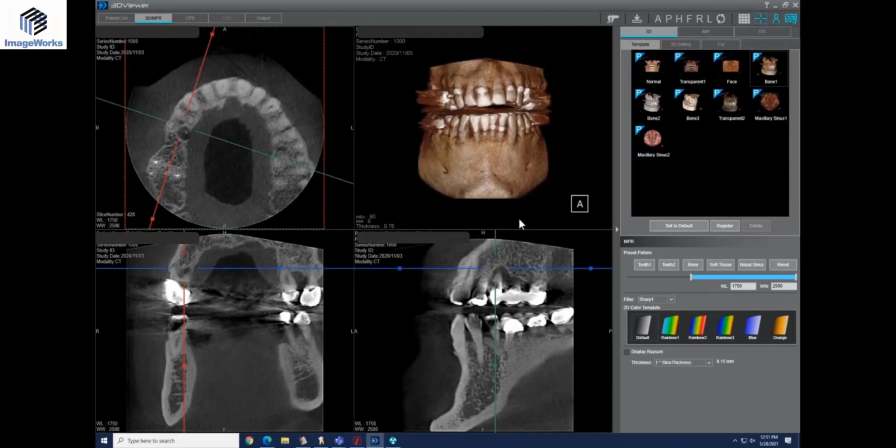But every time, even my staff now, every time I run a cone beam, they come back and they go, what else did we find? Yeah, it's amazing, right? It's funny, to your point, just thinking how you would get this information with just 2D tools. It's hard to imagine.